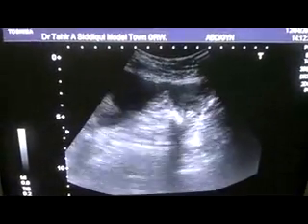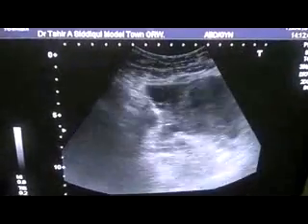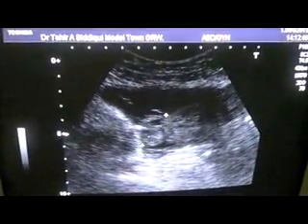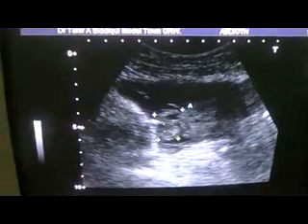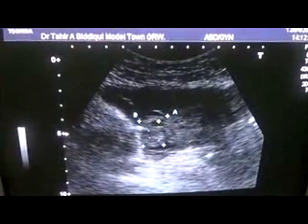Now in transverse section, this is the ovary. You can see follicles developing within it, measuring 2.7 by 2.4 cm. These areas are representative of follicles.